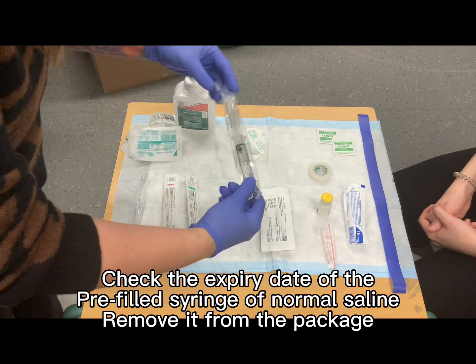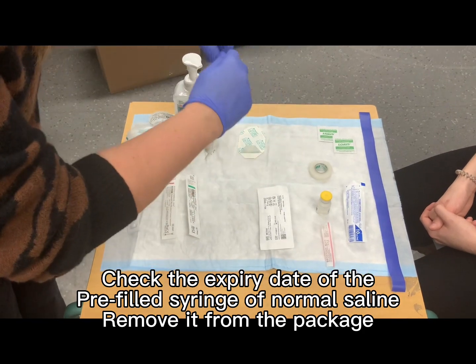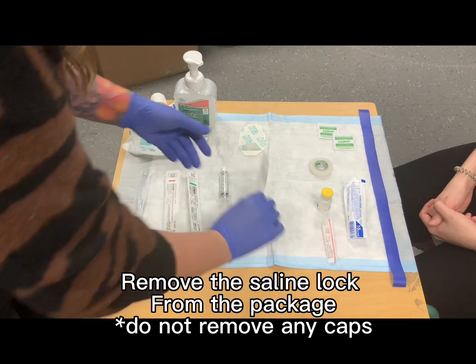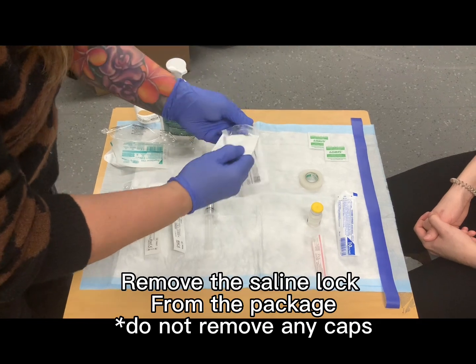You can use a pre-filled normal saline syringe, as shown here, by checking the expiry date and removing it from the plastic. Remove the saline lock from the package. Leave all caps in place and leave the lock inside the plastic itself.